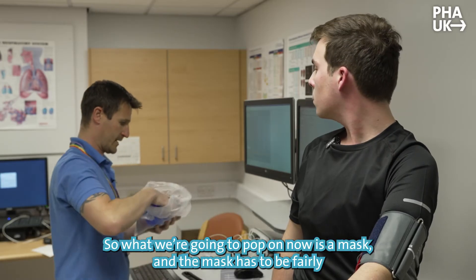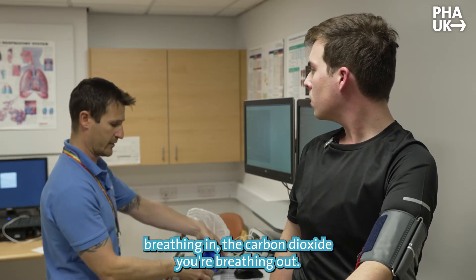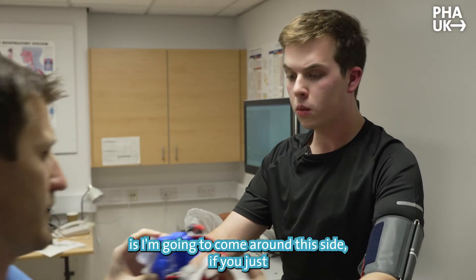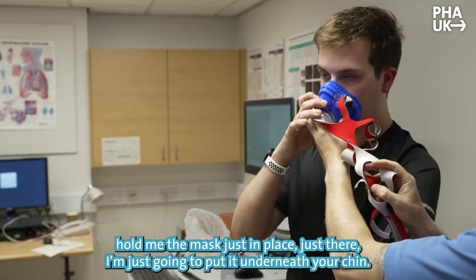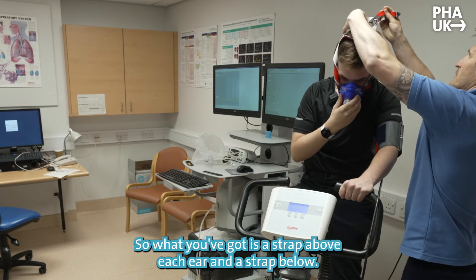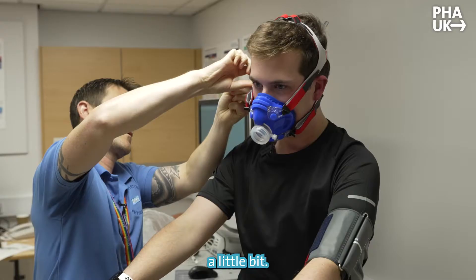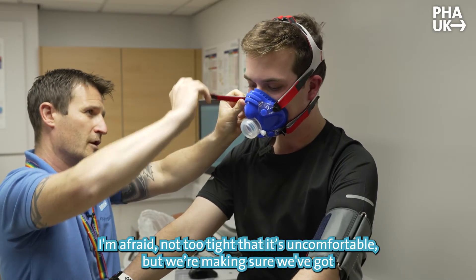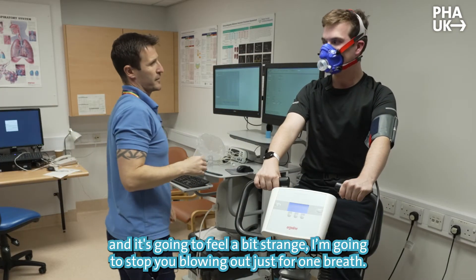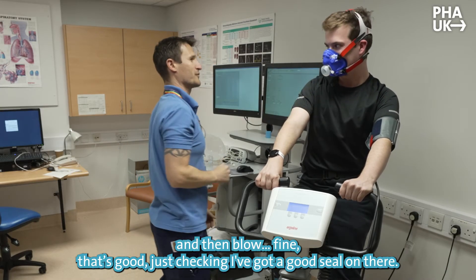What we're going to pop on now is the mask. The mask has to be fairly snug — it has to record all your ventilation and breathing, the oxygen you're breathing in and the carbon dioxide you're breathing out. I'm going to come around this side. Hold the mask in place just there, I'm putting it underneath your chin. This comes up and over your head — you've got a strap above each ear and a strap below. I'll tighten these up with the velcro — it's going to be fairly snug, not too tight, but making sure most of the air comes in and out through the hole at the front. I'm just going to check the seal — take a breath in and blow. Good seal, that's good.